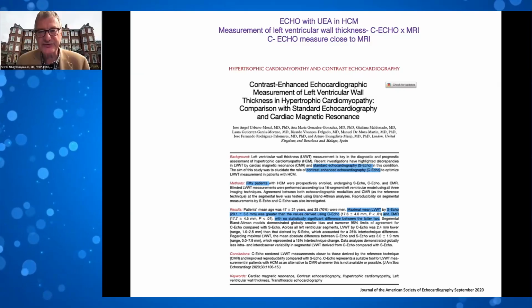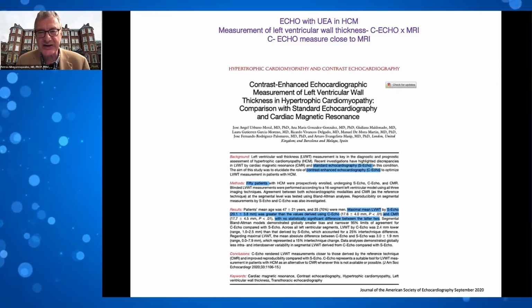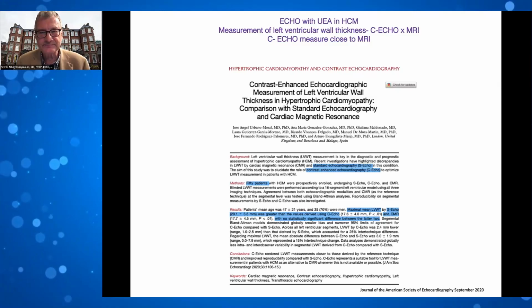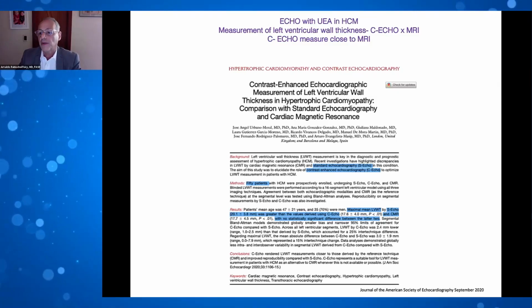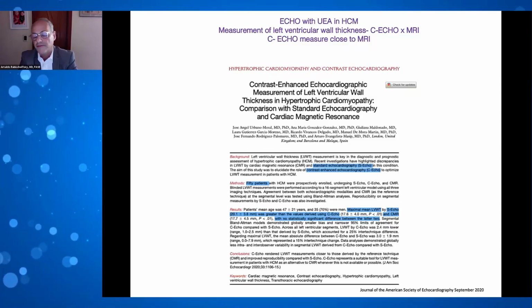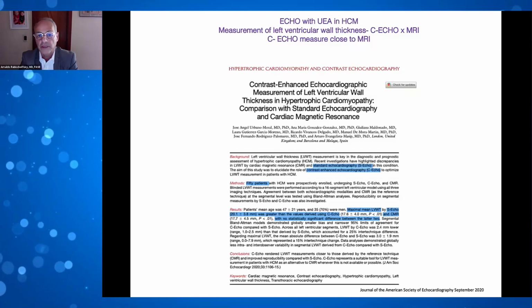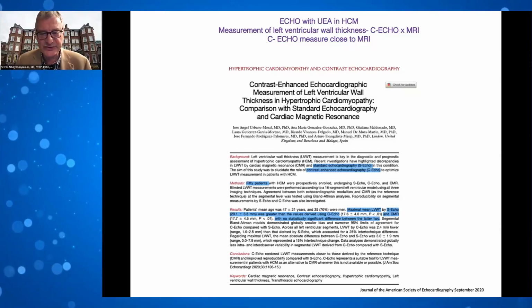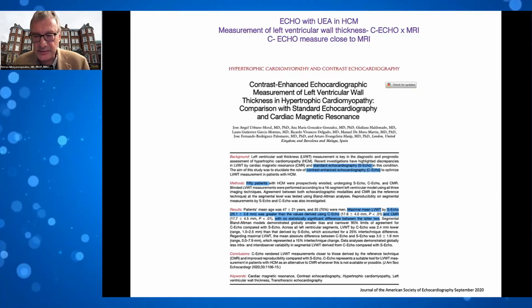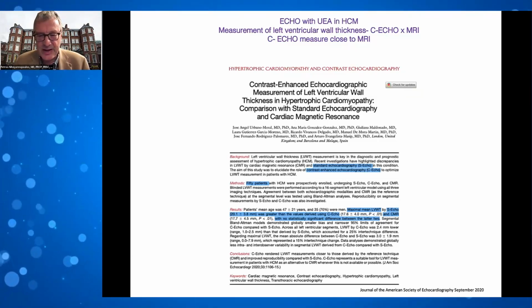So is it fair to say that in Brazil, qualified nurses can inject contrast? Yes, but remember, I work in a private hospital. In a public hospital, I think it will be very hard to establish this routine. Okay. Point taken. Thank you very much again, Arnaldo, for this very good presentation.